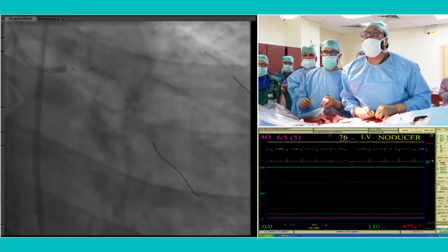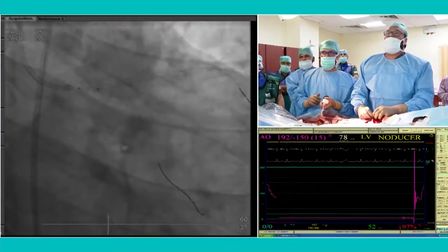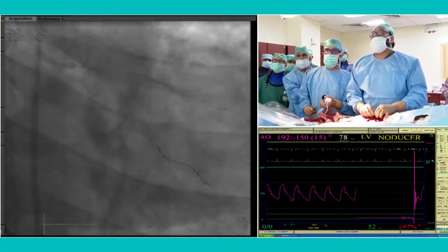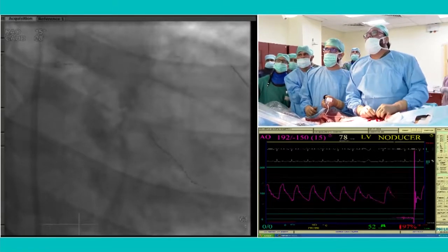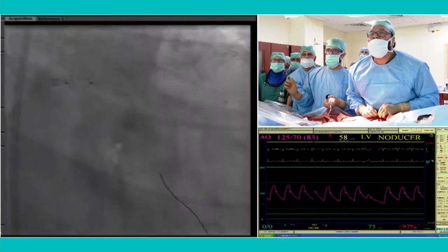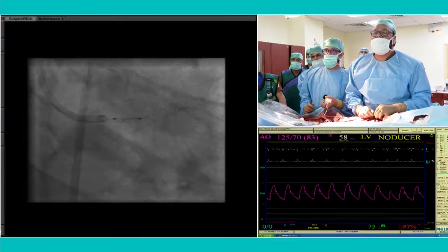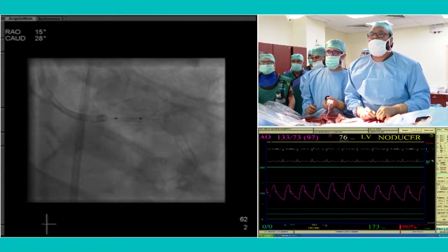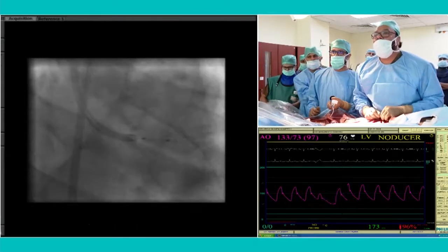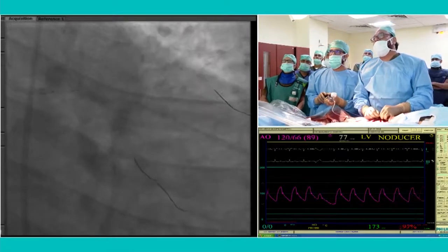Stent boost. You want to check? Yeah, you just give a stent boost, please. It's not come properly. Just show a little, please. We're just doing a stent boost to check the position of the balloon. Perfect. I think we are absolutely fine. Yeah, go ahead.